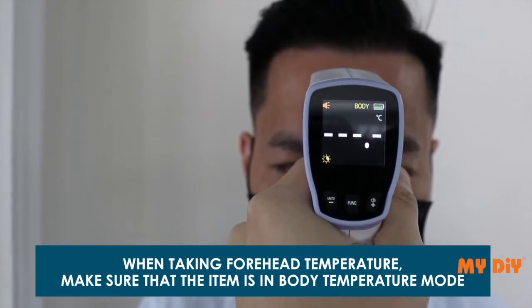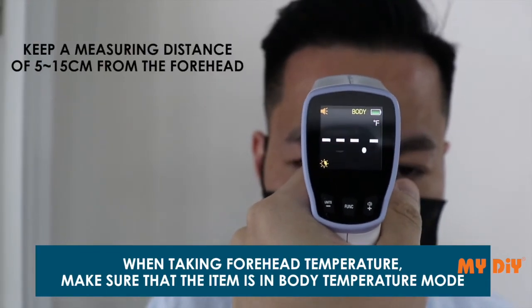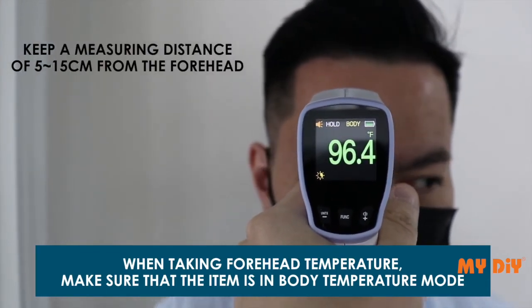When taking forehead temperature, make sure the device is in body temperature mode. Keep a measuring distance of 5 to 15 centimeters from the forehead.